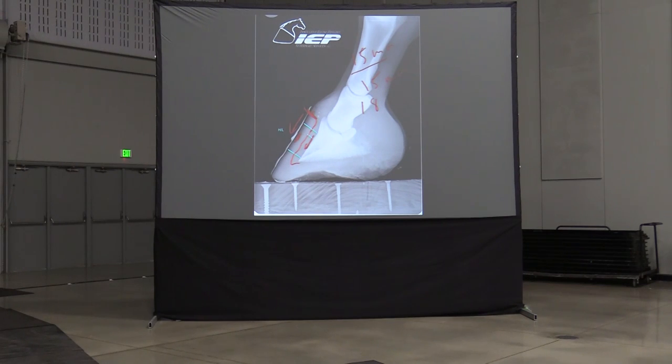The lamellar zone is what I typically monitor really close, and it stays most of the time around 7.5 millimeters across all horses. From a laminitis standpoint, you can see that swell early on, as much as 3 or 4 millimeters before there's any radiographic displacement. You'll see that lamellar zone start to change.